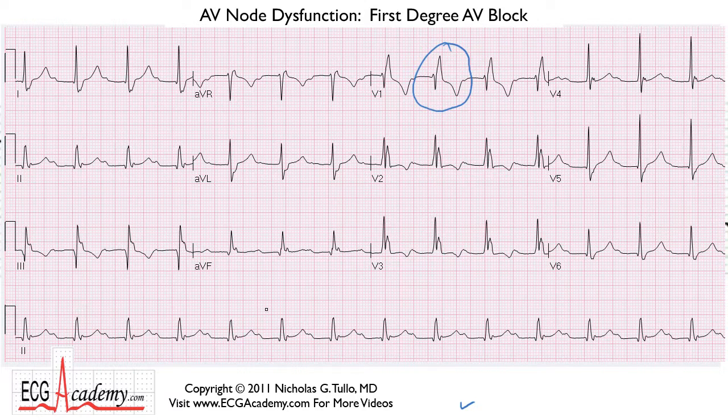If you scan across, you see that the QRS complexes are quite regular at a rate of about 300, 150, 100, 75. It's somewhere between 100 and 75, closer to 75. I'd call it at about 85 beats per minute. And where is the P wave? If you look in front of the QRS complex, you really don't see a good P wave there.